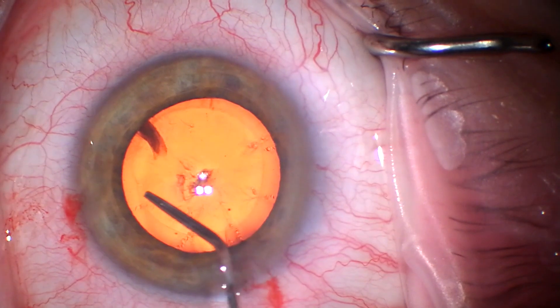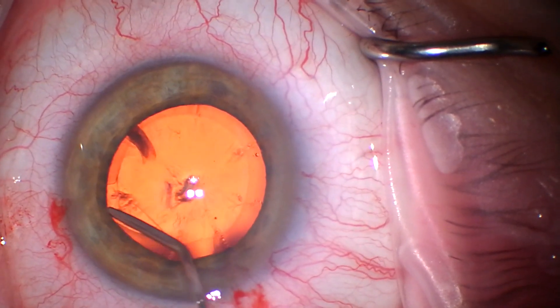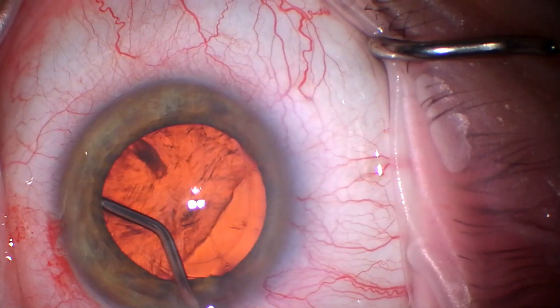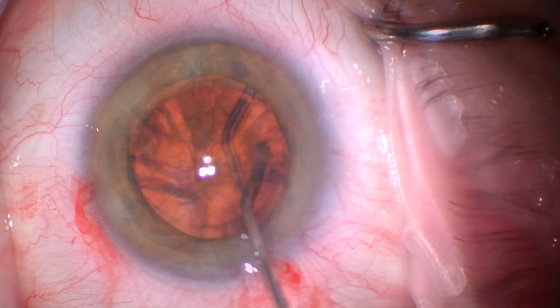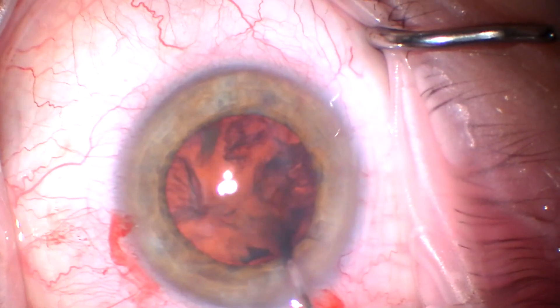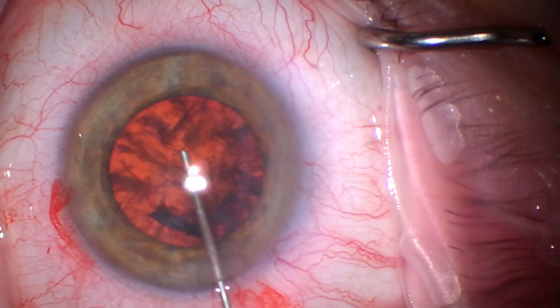And we'll hydrodissect. I hope to do a few videos over the next few weeks showing different techniques of FACO. This is a horizontal chop as you'll see in a minute, and I'll also do vertical chop as well as a fair amount of laser assisted cataract surgery.